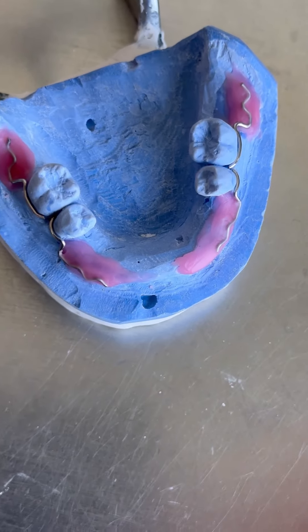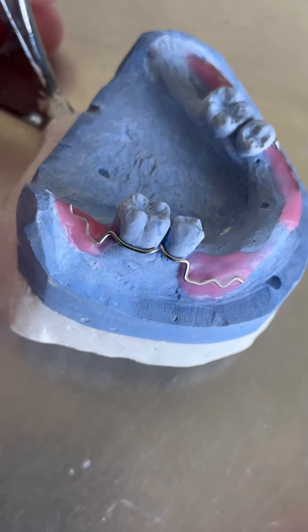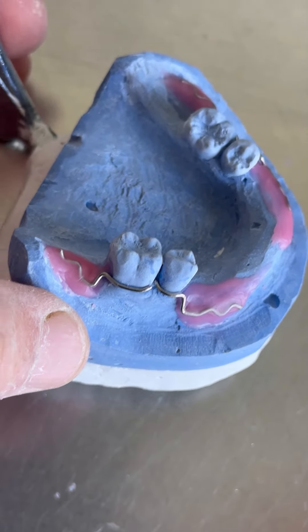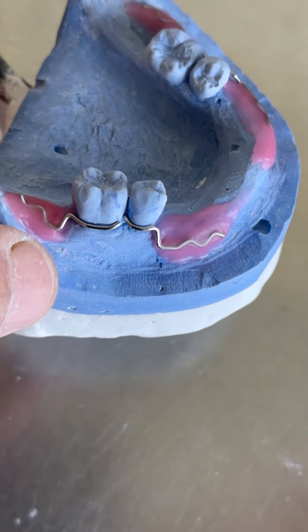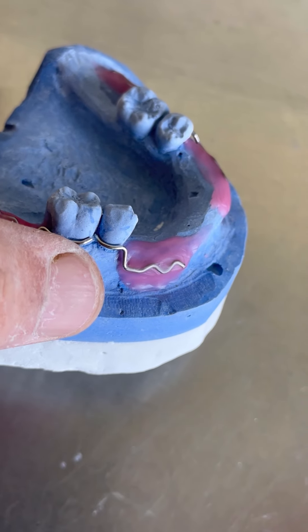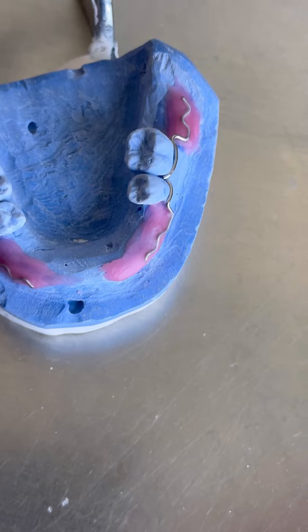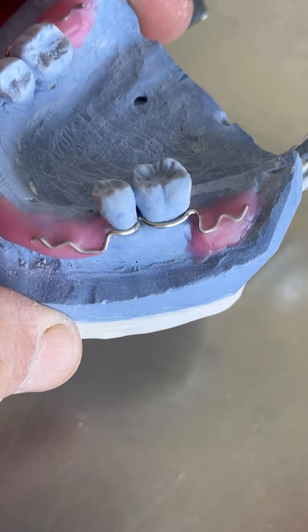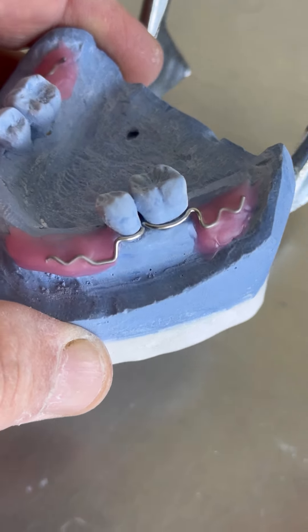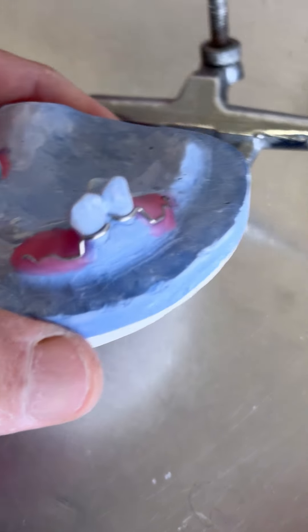Ещё надо будет приготовить два крючка. Вот смотрите — я их зафиксировал на воске. Теперь эти места надо будет зафиксировать акрилом, который застывает от ультрафиолета. Ясное дело, крючки должны находиться ниже экватора. Вот этот рычаг, который вниз идёт — это будет давать возможность этим кламерам, этим крючочкам работать. То же самое с обратной стороны — ниже экватора, тоже тут зафиксируем.